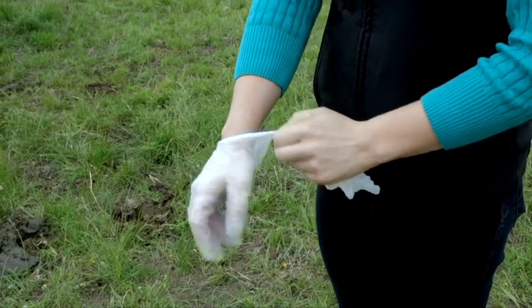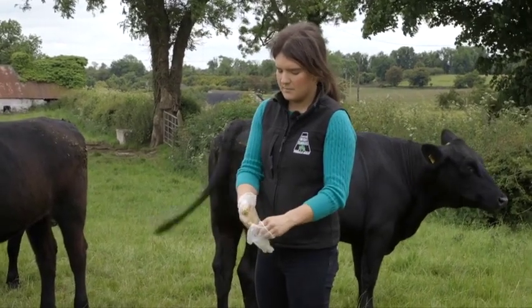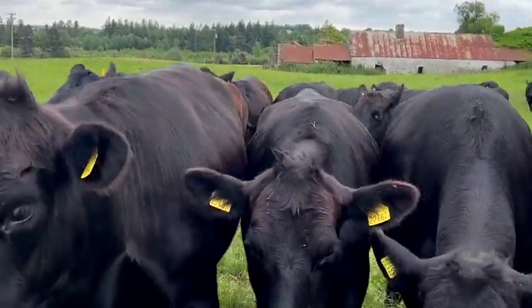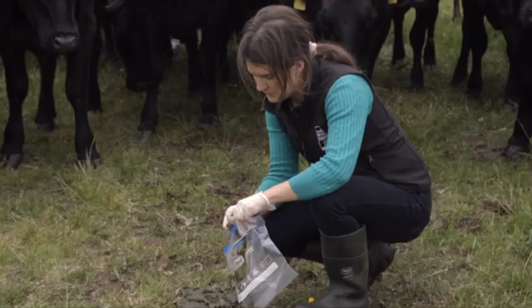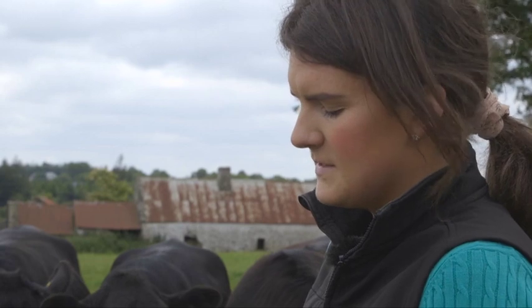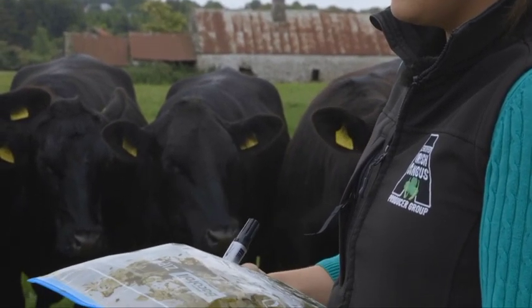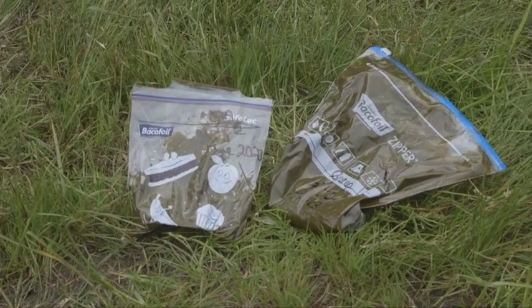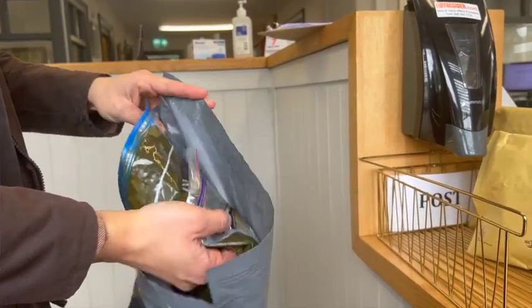Wear gloves when taking a sample and be sure to keep gloves clean between each sample to avoid cross-contamination. It is best to take samples early in the morning, ideally after dunging, and take them when they are fresh. Place the sample in the pot or bag and label it with the date and batch number. Label all herd details on each sample pot and ensure prompt delivery to the lab.